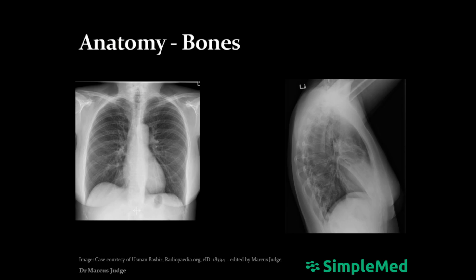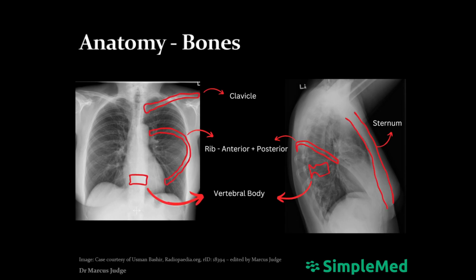As part of B, we assess the bony anatomy, looking in particular for fractures or abnormalities. It is very difficult to assess for rib fractures on a chest X-ray, but it is also very common to miss them by not attempting to look, and fractures can cause punctures of the lungs and explain other clinical findings. The clavicles are fairly clear to see, but it can be difficult to fully understand how the ribs sit. Since this is a PA film, we are seeing the ribs from behind, curving round and forwards towards the sternum at the front. The vertebral bodies of the spine can be used as a good marker of technical adequacy and film exposure — they should be visible and distinguishable on your film.